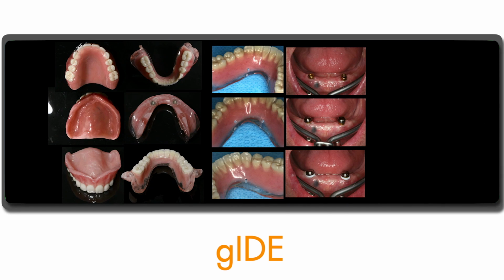You can probably see there are new locators on the upper right-hand side. It's a shorter locator. The previous one was much longer, and because it was longer, it was having more trouble with the divergence of the implant. So we've changed it to a shorter height overdenture, and we've done a direct pickup in the mouth.